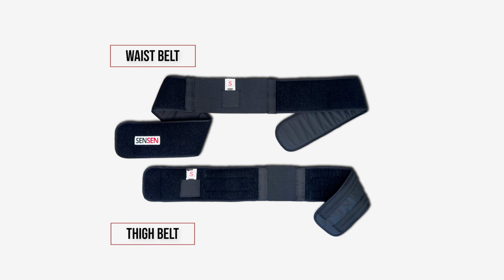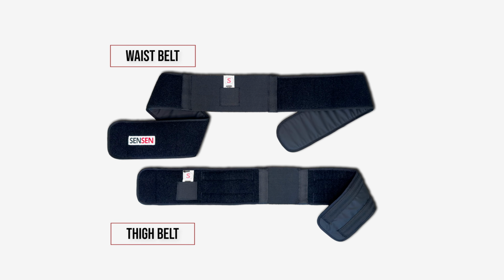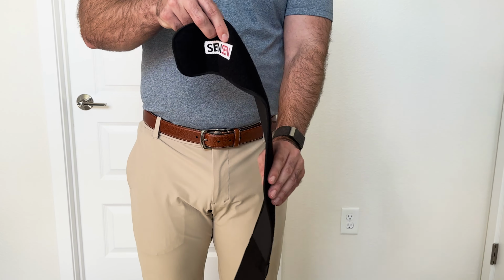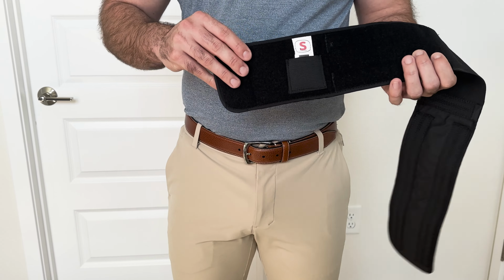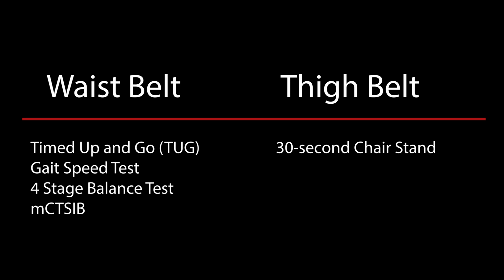SenSen includes 2 belts, each with a pocket where the sensor fits during testing, a waist belt and a thigh belt. The waist belt, the longer of the 2, locates the sensor on the client's lower back at the sacrum. The thigh belt, the shorter belt, locates the sensor on top of the quadricep. The waist belt is used for all tests except the chair stand, and the thigh belt is used only for the chair stand.